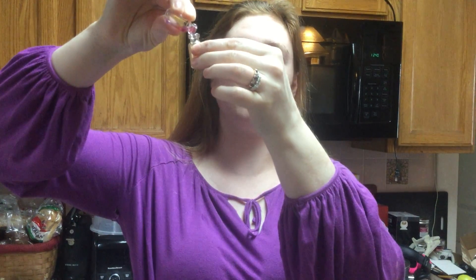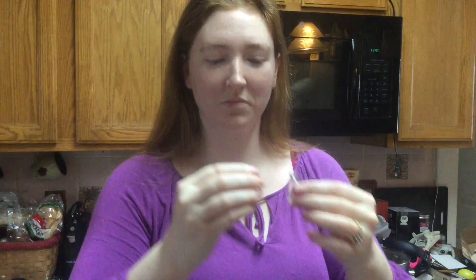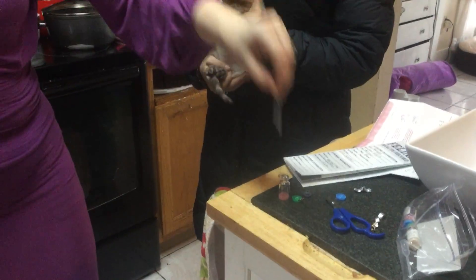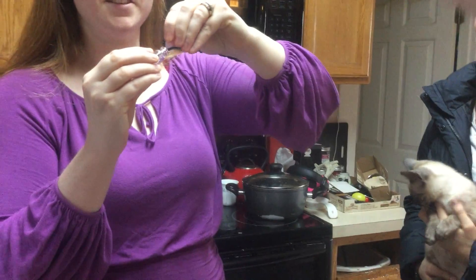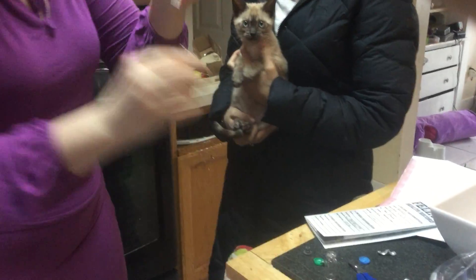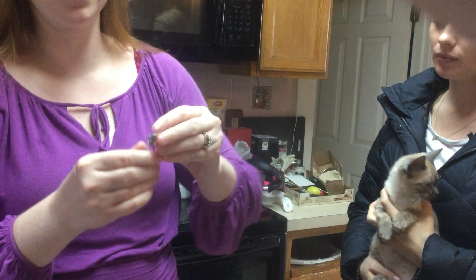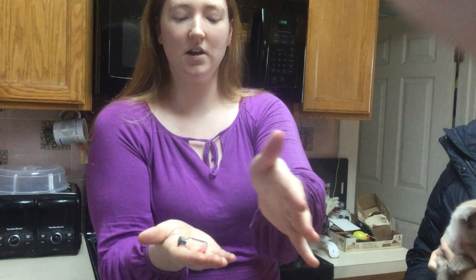I think the best way to do this is to suction it up with the pipette that you are given, put it into the liquid. These are vaccines that will not bother you — they're for animals only and won't affect people. You want to mix it by putting it in your palm and rolling it very gently back and forth. You don't want too many bubbles because that will interfere with getting the full dose into the pipette.